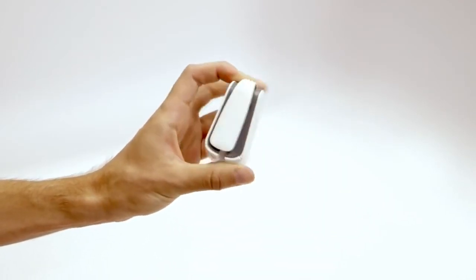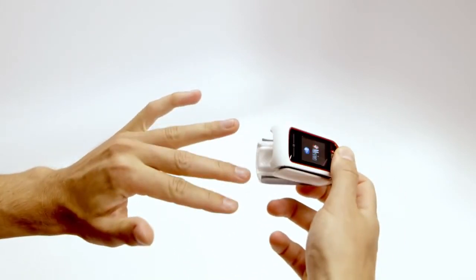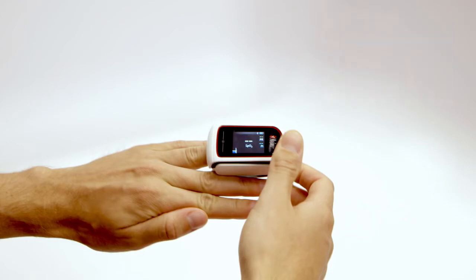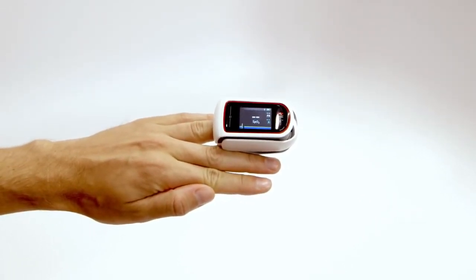To take readings with the MightySatRx, open the device by simply squeezing the back portion as shown. MightySatRx will automatically activate when the device is open so that the sensor pads are exposed. Position the finger so that the tip of the finger touches the backstop at the end of the sensor pad. Ensure the finger is correctly positioned for accurate measurements. Once correctly positioned, gently close the MightySatRx by releasing the pressure on the back of the device.